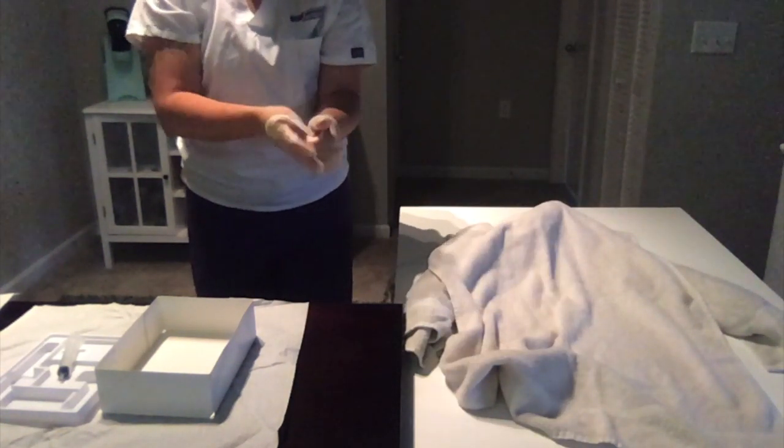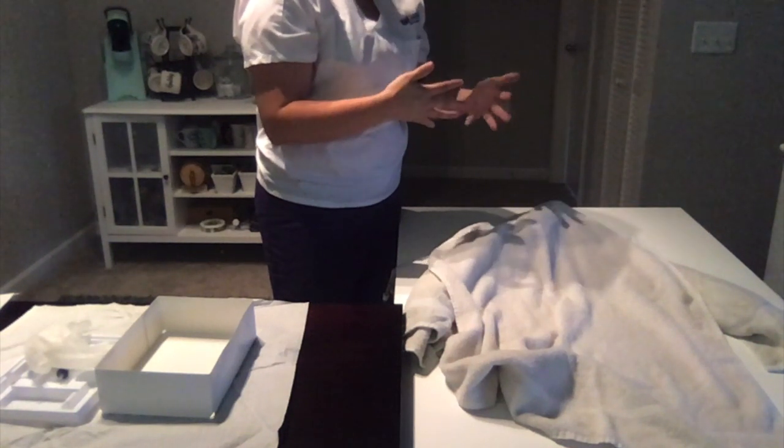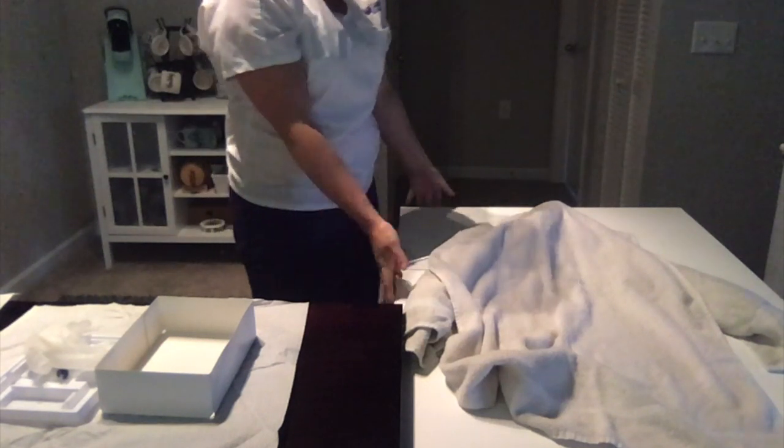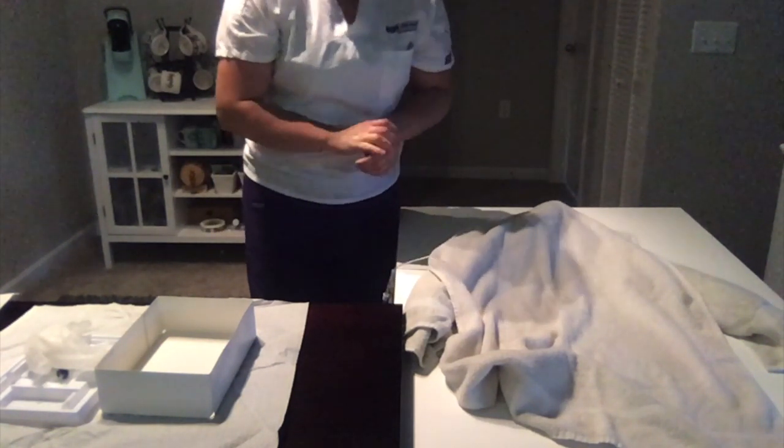I'm going to take off my gloves and wash my hands. And then I'm going to lower her bed and say, Miss Smith, do you need your call light? Would you like your phone nearby? Any personal belongings she wants nearby. But making sure that the bed is in the lowest height to prevent falls.